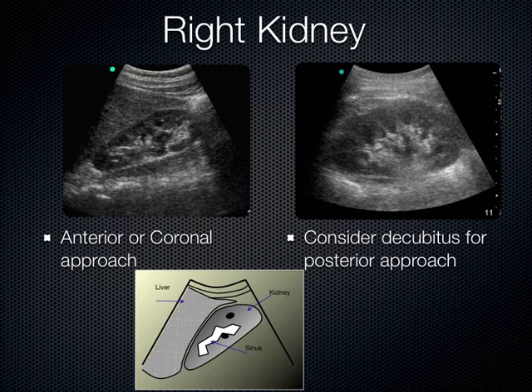And we can see this image over here is the kidney. Here's the kidney cortex here. Here's the organ next door to it, which happens to be the liver on the right side of the body. And we lose the lower pole of the kidney.